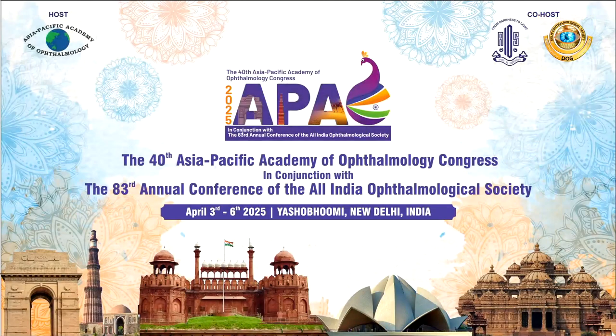Nice presentation. But since we do expect capsular instability in these eyes, you have put a CTR. But could you have gone a step forward and done a reverse optic capture kind of situation? One question. Second question, with the possibility of a capsular instability on the table or later on happening too, was it wise to place an EDOF lens, that too in a post-refractive surgery?